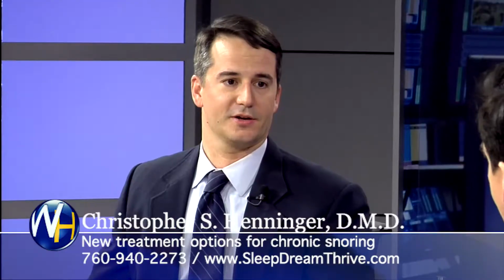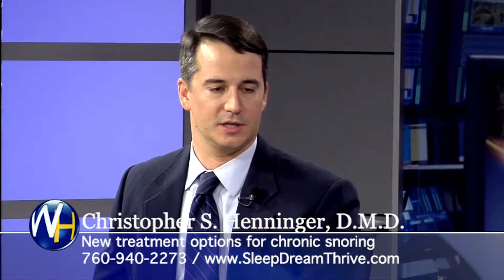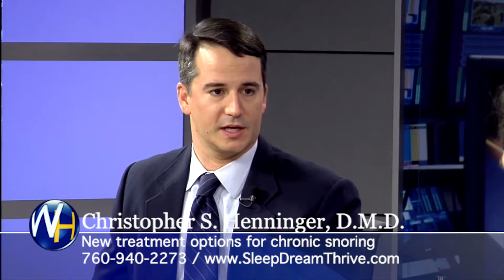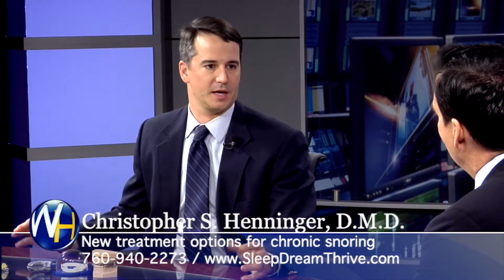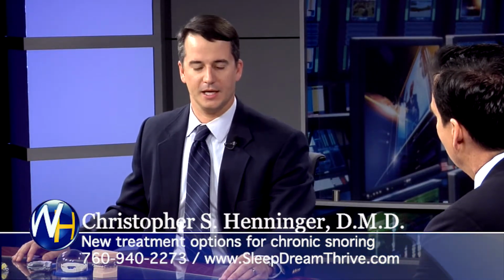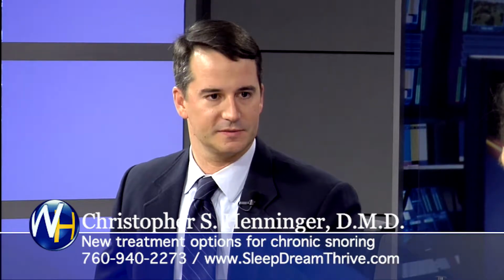So did you send her to a sleep lab? No, we actually tested her in my office. I'm so passionate about this. I have a home sleep test that you can use for 2 nights, and I don't charge patients for it because I'm so passionate about helping people figure this out. They go home with this little headband type thing and they wear it, and it measures 7 things about how you sleep: your position, how much oxygen is coming in and out, if you stop breathing, the noise that you make. So she took it home, and sure enough, she had borderline moderate to severe sleep apnea.